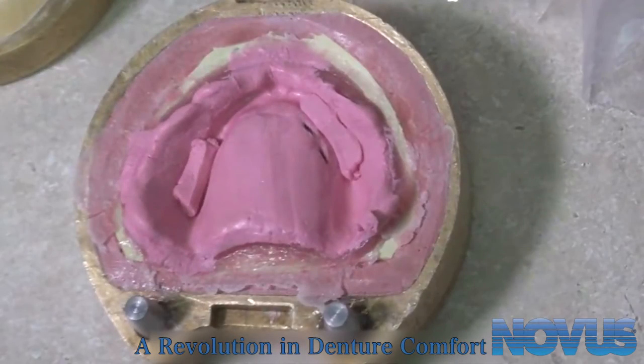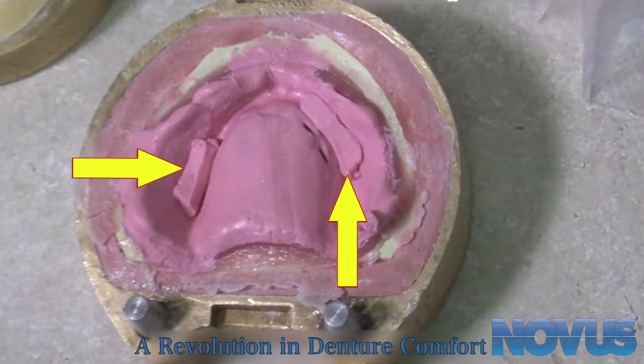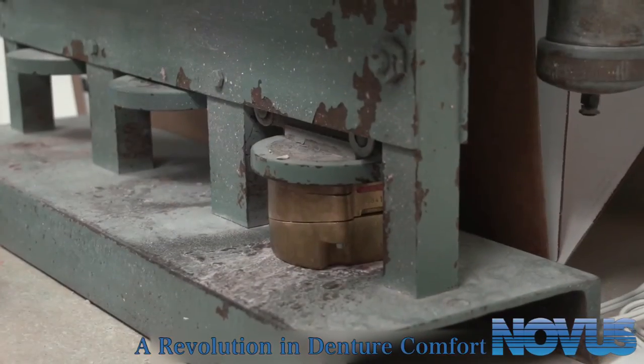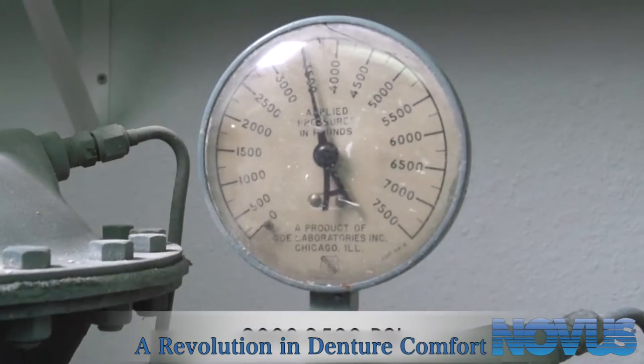Do a final inspection of under-packed areas and again add more Novus where needed. You will not use a polyethylene sheet for the last pack. Close the flask a final time and place it in the presser and apply 3,000 to 3,500 PSI.